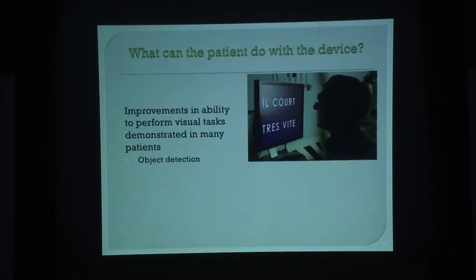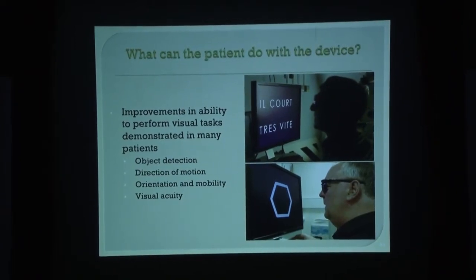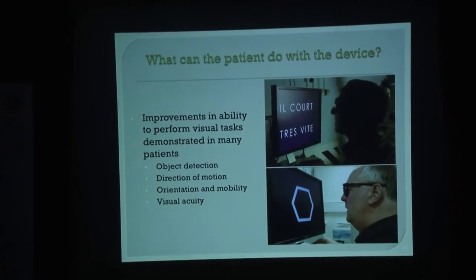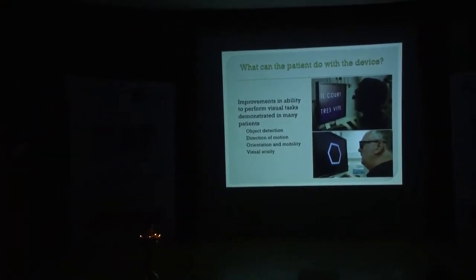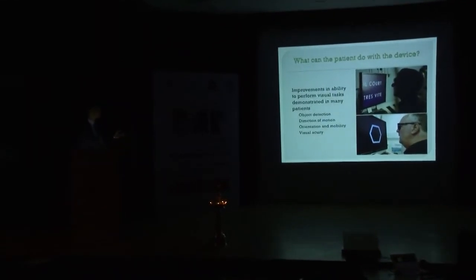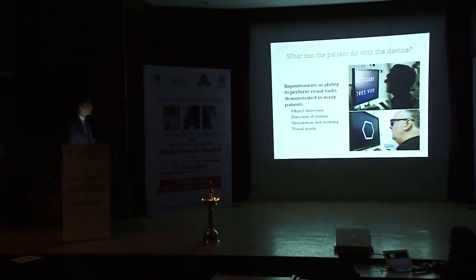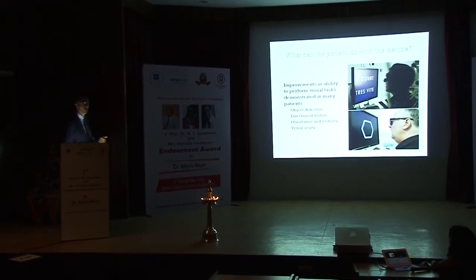That is what in practice a patient can do with a device. It helps a lot to detect objects, which otherwise would be impossible for this blind patient to do. So they can recognize where the objects are located, they can grab objects and they can recognize them. It helps them in understanding where an object comes from. For example, if you are walking with your stick and you are trying to cross a road, they can understand whether a car is coming from the right or the left side, and it also helps in movement. Most of my patients don't go around anymore with a dog, but use only the stick to ambulate on the street, for example. And some of the patients also had an improvement in visual acuity and they were able to read.